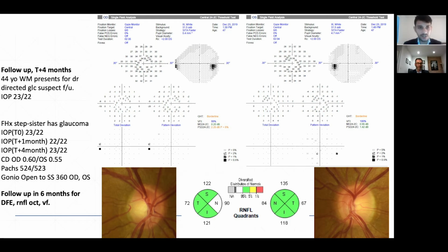So this patient came back about 4 months after our initial presentation, and this is actually a 24-2C. This is a newer Humphrey visual field protocol. I've started using this on all my patients now. I don't do the normal 24-2 anymore. This is fantastic because it's the regular 24-2 protocol, but it also has 10 macular points. We were talking about how important the macula is in all grades of glaucoma. Well, this is really aligning what we do clinically with what the research is showing. So I've been using this quite a bit.